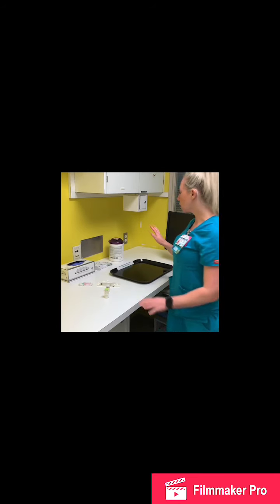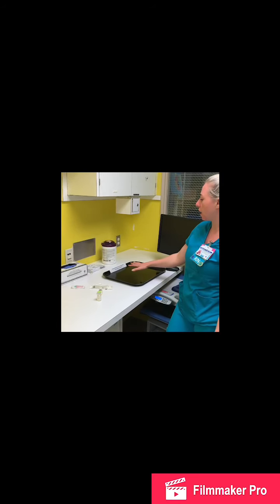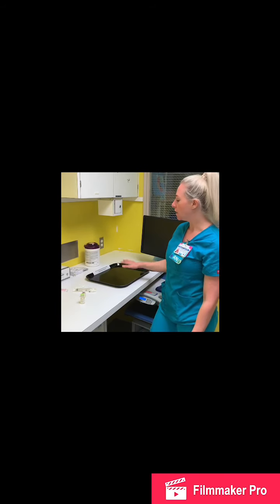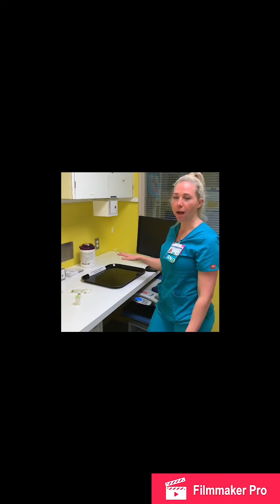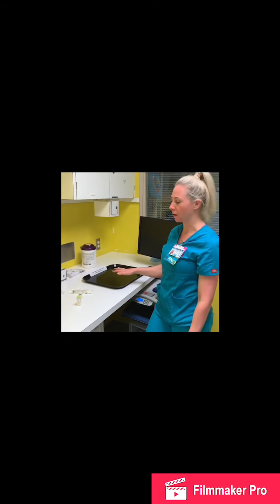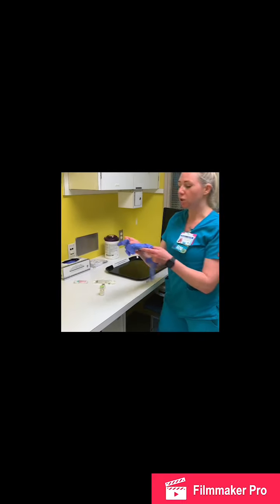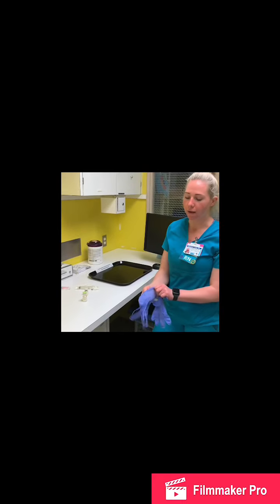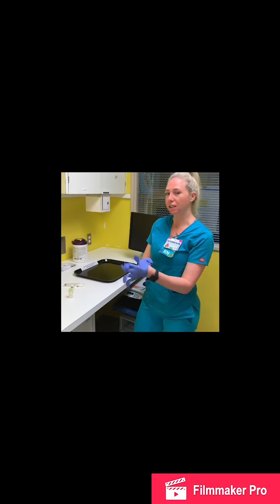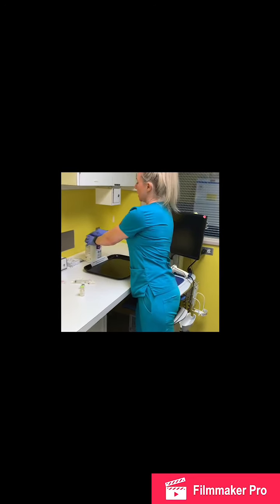So we are going to be having a sterile product preparation area that will be set up on every unit. This is what it's going to look like. It's a black tray and it has a special sign on it that tells you exactly what the area is made for. So prior to reconstituting your medication, you need to wipe the area down with your purple top wipes to make sure that it is clean and sanitized and we're ready to go.